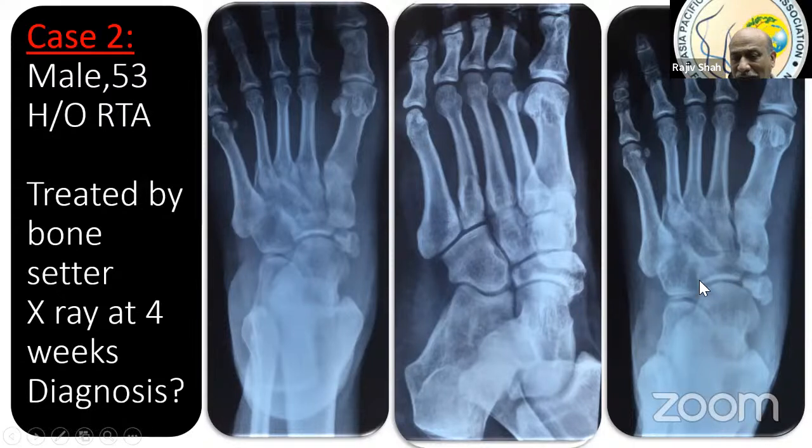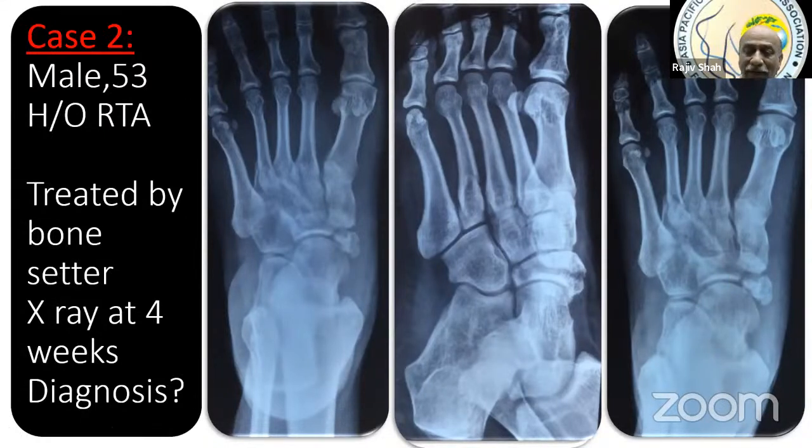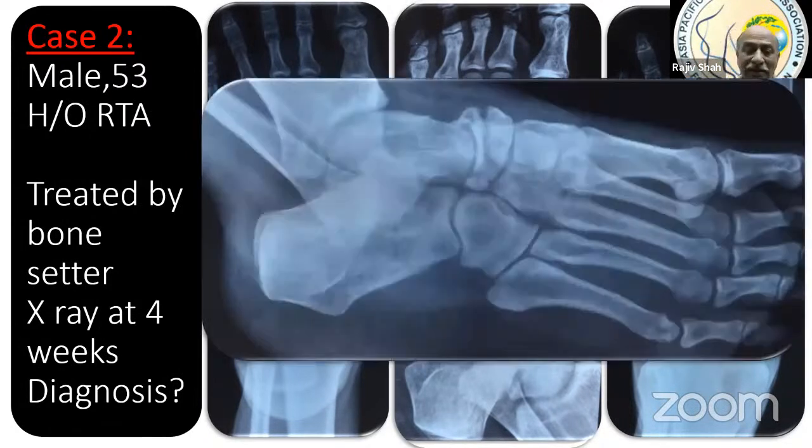Out of the total coverage of talar head by navicular, this fragment is giving 30% coverage. So you need to restore the integrity of cover. Otherwise, if you compress it, then patient would have more exposed talus. That patient can also secondly develop flat foot. So you must put in bone graft, and you must restore the complete integrity of navicular articular surface with talus.